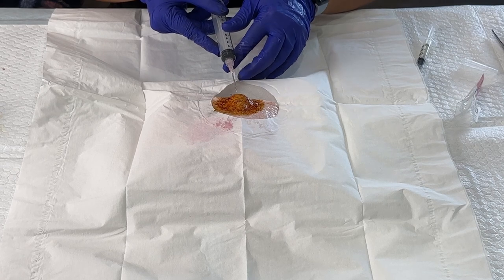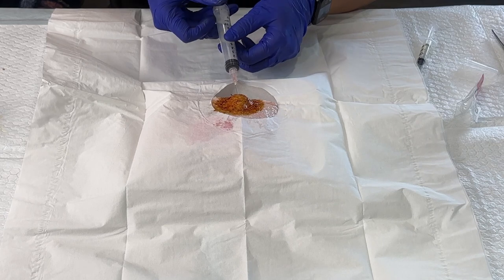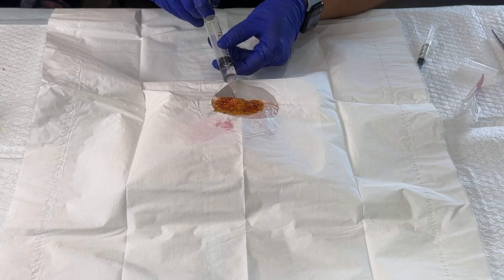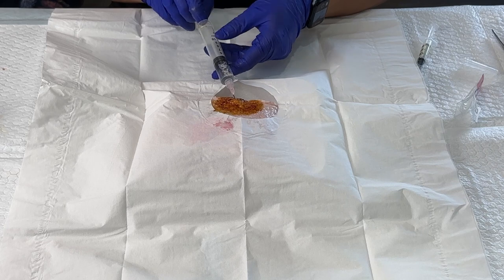I'm going to insert into the ganglion cyst and I feel a little pop, a little give. And once I'm in there, I start withdrawing and you'll see the cyst start getting smaller and the gel — the jelly substance — start filling up the syringe.